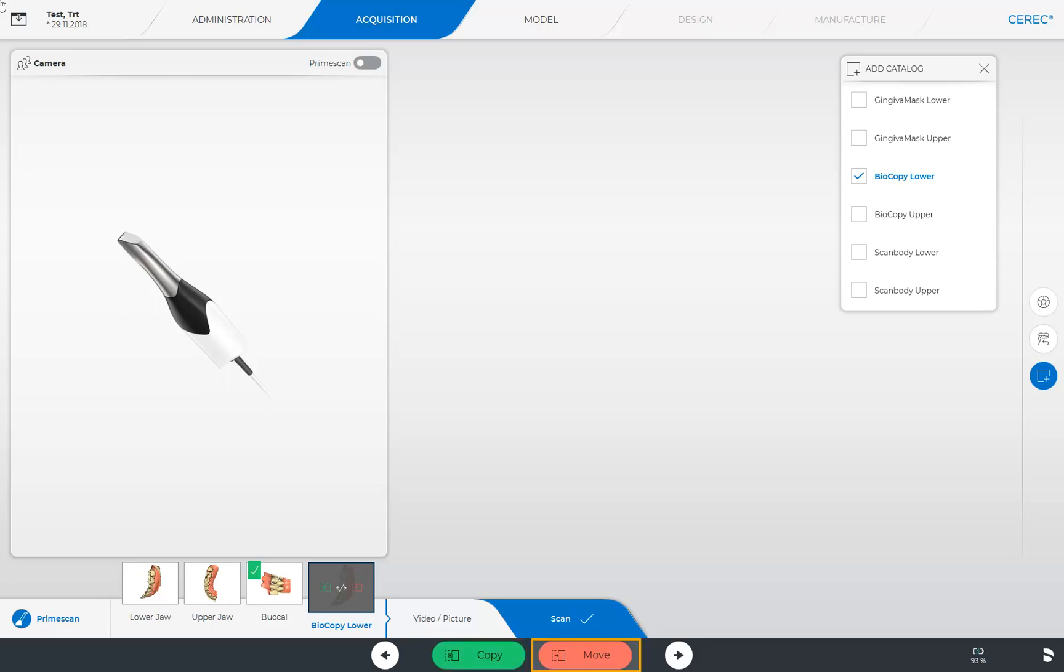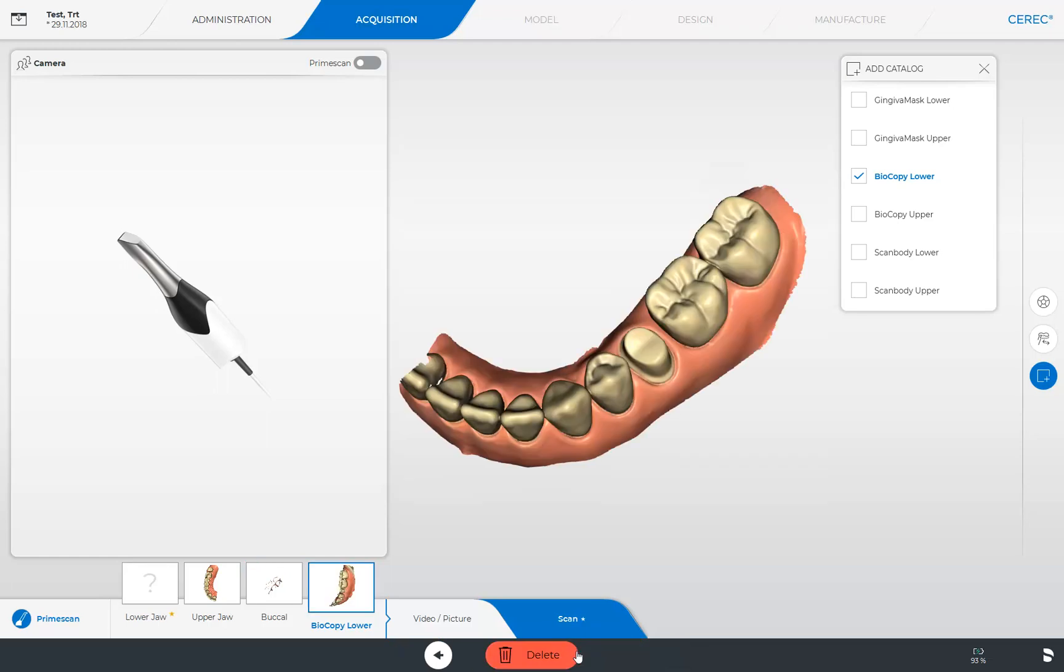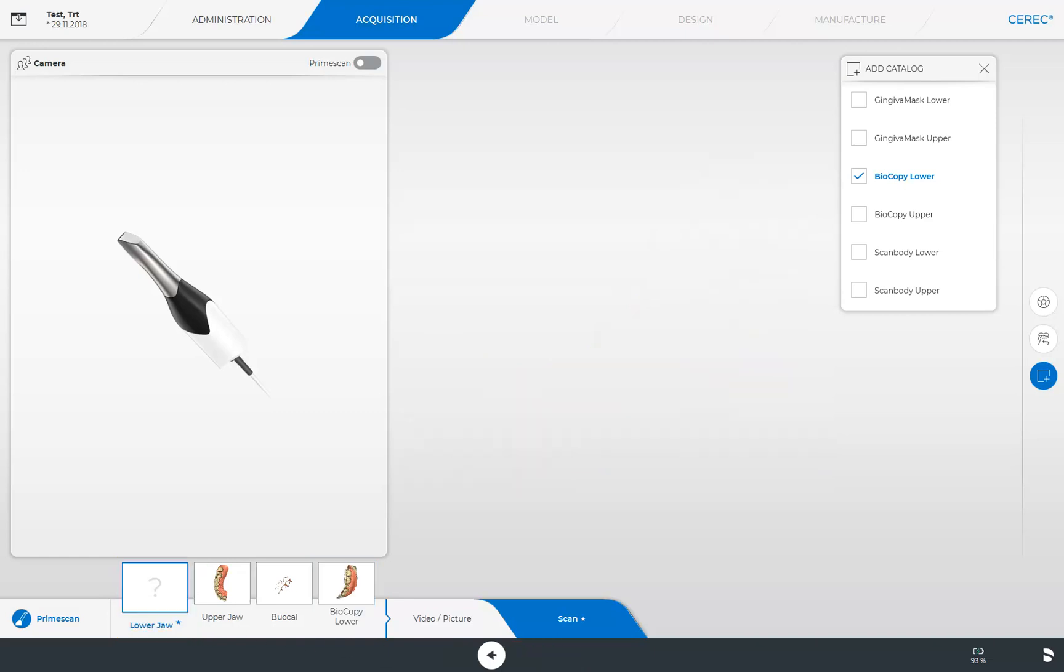In our case, we will move the data so that the image catalog won't display any scan data anymore. To again activate the image catalog lower jaw, we simply tap on it and turn on our prime scan afterwards.